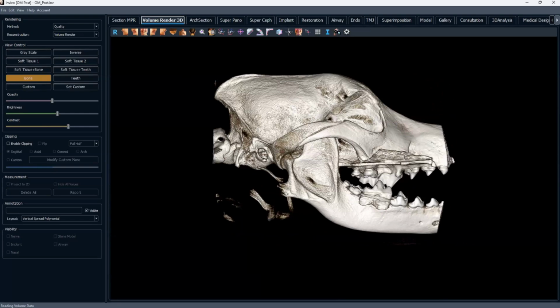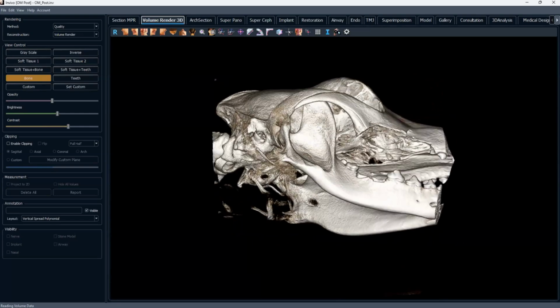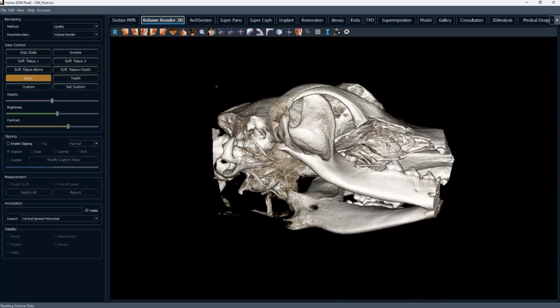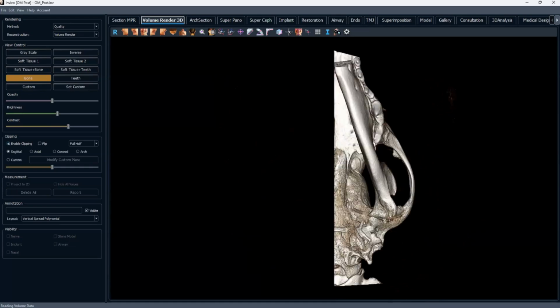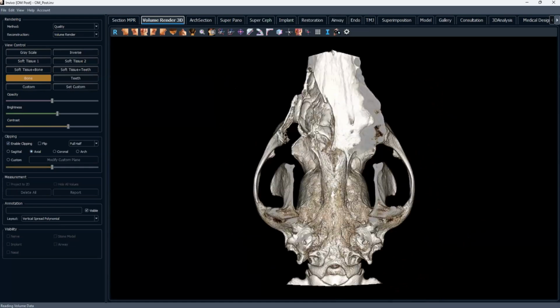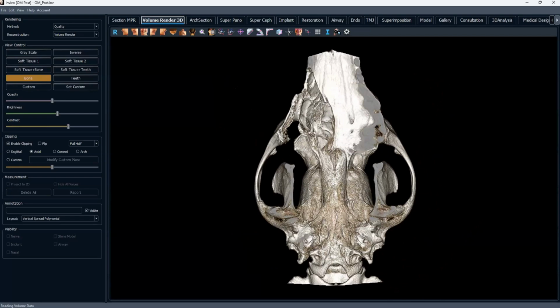On the right side, we can see we followed up right underneath. So you can see the infraorbital canal there. And then as we go back, we got that nice little notch out of the palatine bone going back to the pterygoid. If we go back to our clipping, you can see there's a little bit of a dog leg in the palatal cut there.